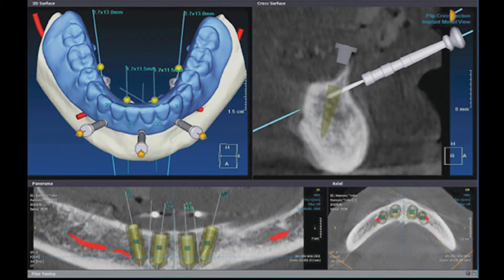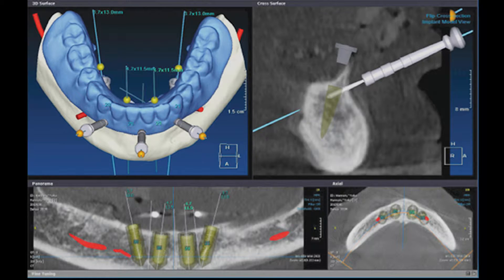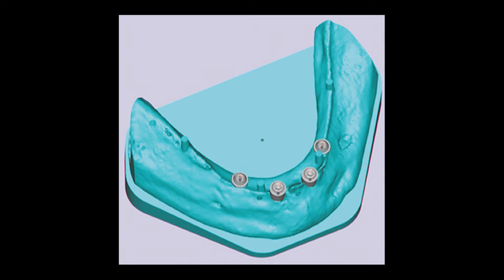Once the datasets were accurately merged in the treatment planning software, we virtually selected and placed the implants at optimal positions and angulations for the available bone volume and prosthesis support. The two posterior implants were angled to fit within the greatest volume of bone and increase the anterior-posterior spread of the restoration support. Multi-unit abutments were used to correct the angle of the two posterior implants and to provide a common restorative platform across all implant sites.